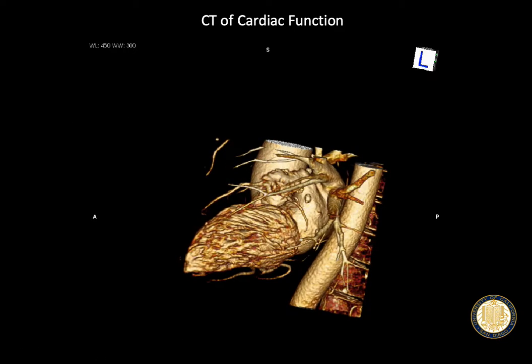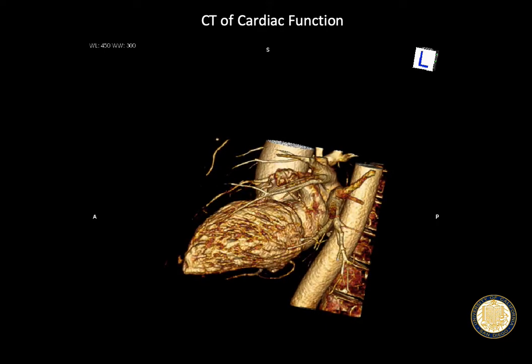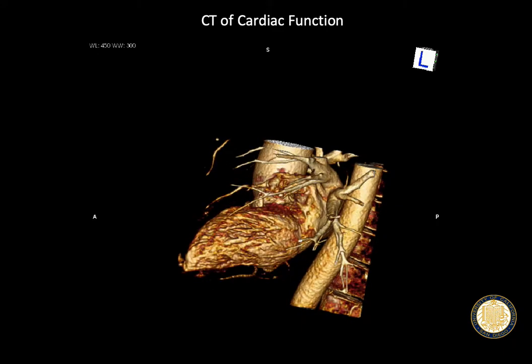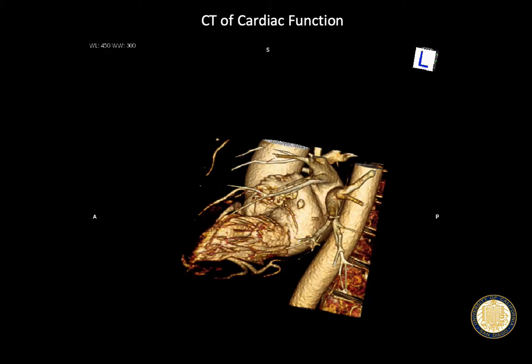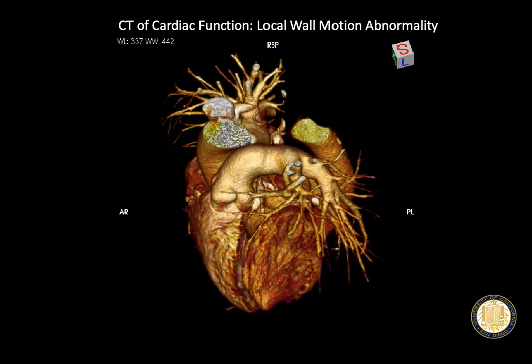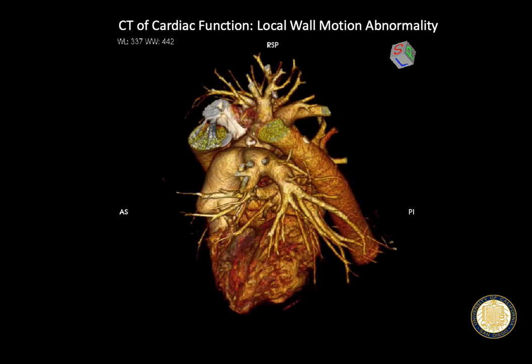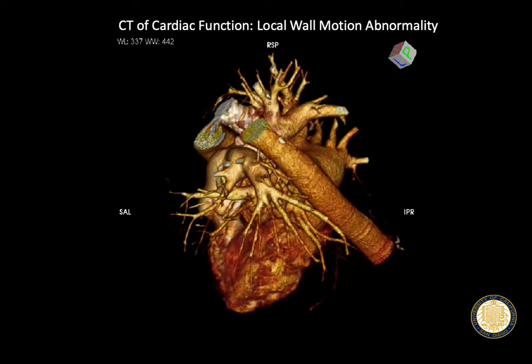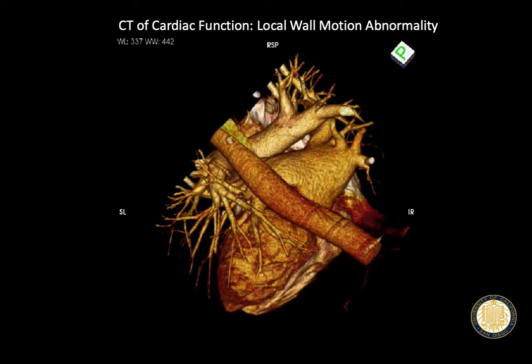There we go. So this is a cast of the blood volume, and it gives you all of that high spatial resolution structure that is there. And because that's a material property, those features can move and deform, but they're part of the myocardium, so you can use them to visually perceive what's happening. So here's that infarct. And if you come around, you can see that those textures aren't really deforming in that area of infarct relative to the other parts of the heart.